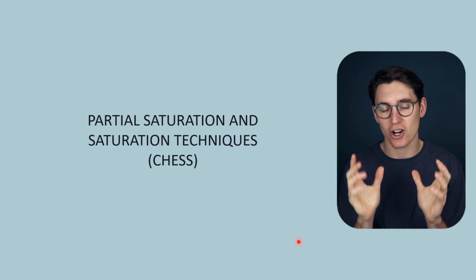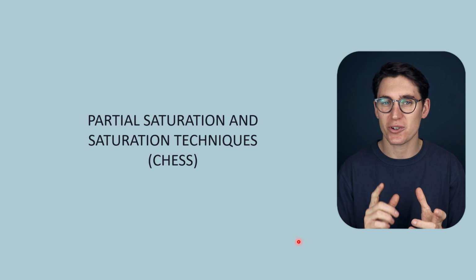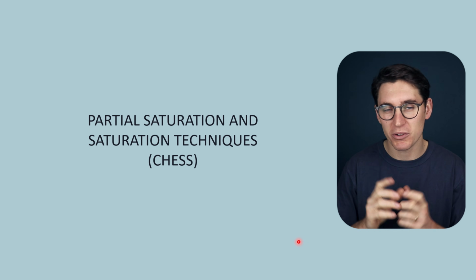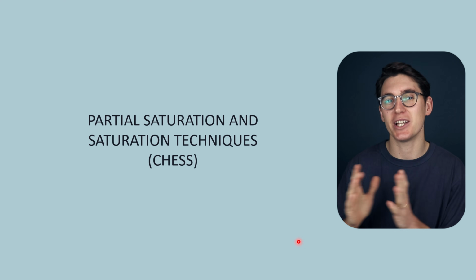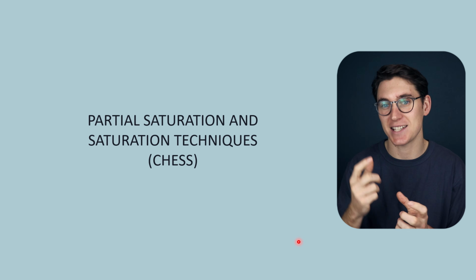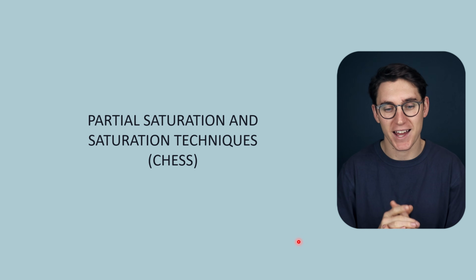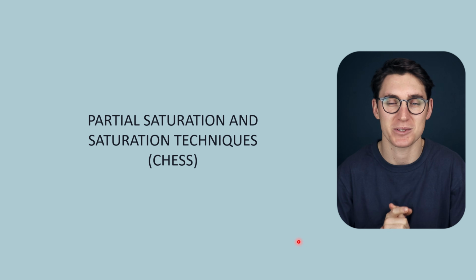I've decided to start off by looking at this concept of saturation. Now, saturation is an incredibly important concept to understand as we head into these more advanced techniques. When we focus on MR angiography and time of flight, we'll see that saturation plays an important role. When we look at trying to reduce artifacts, a motion artifact within an image, we use something known as saturation bands to reduce artifacts. And understanding the concept of saturation is incredibly important within these pulse sequences.